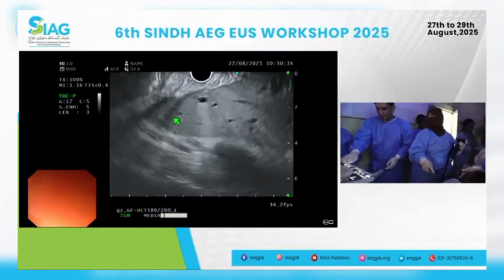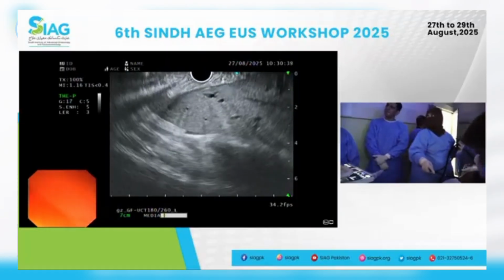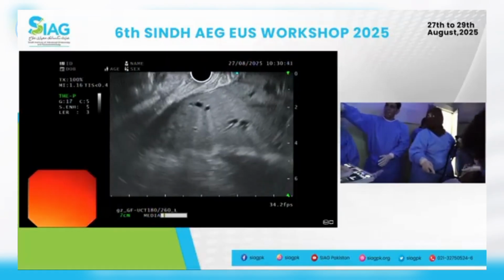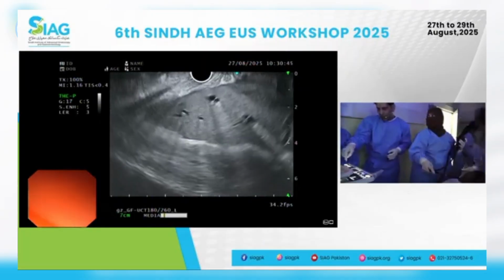Remove the pointer. I'm saying some of the ducts have whitish content. Yeah, exactly. Absolutely. Nadeem, can you hear me? Yes, sir. Will you use Doppler? Let's have a Doppler.